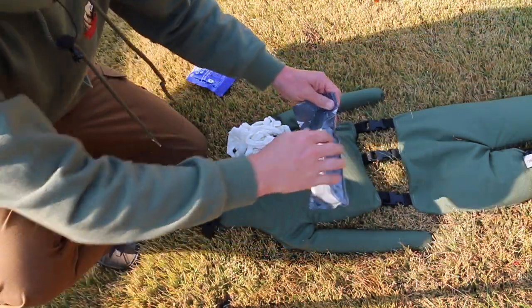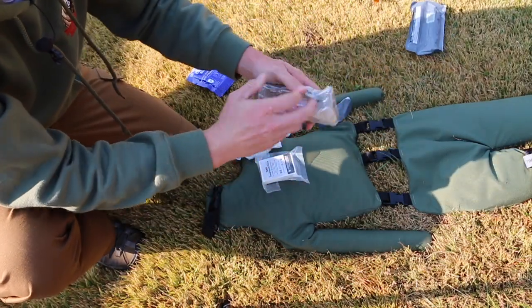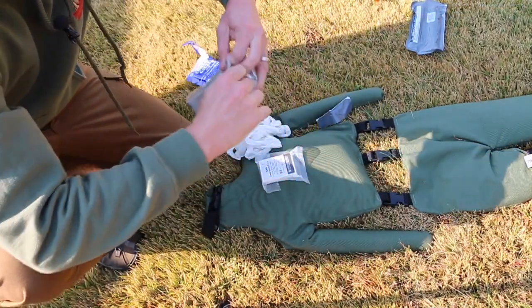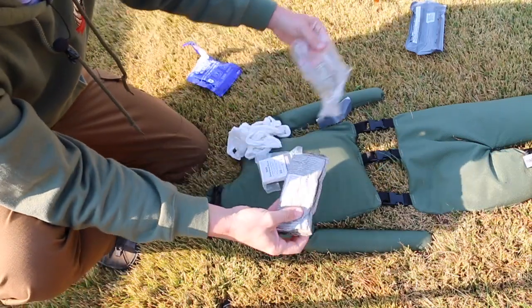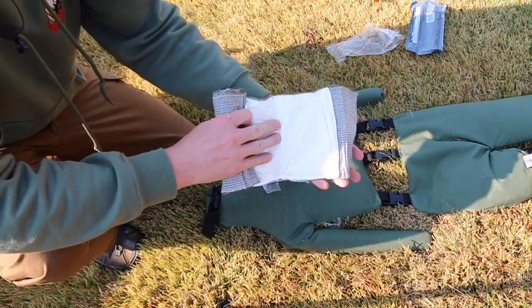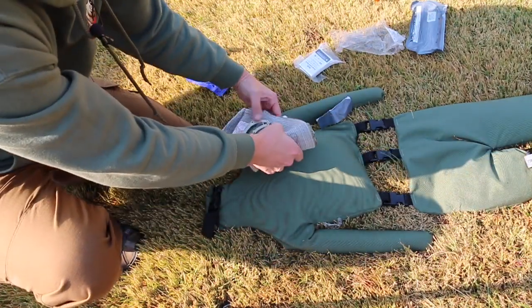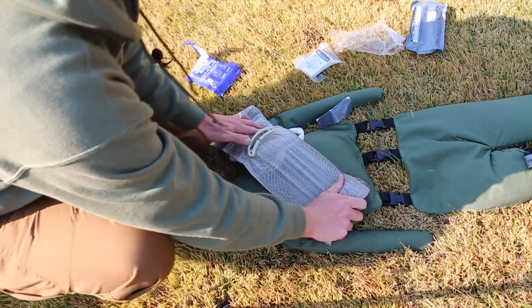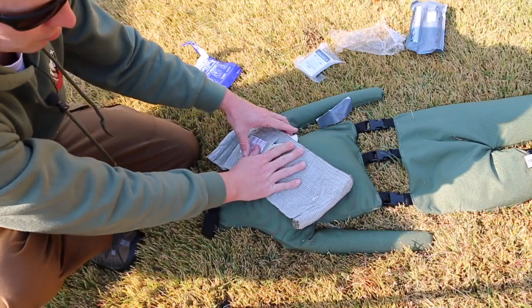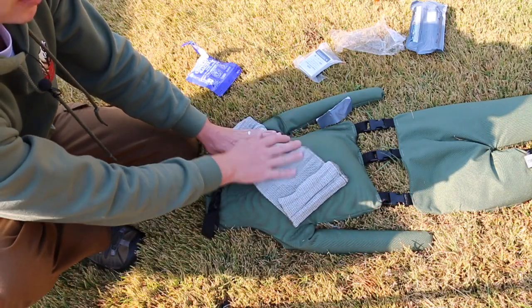All right, this is a little difficult on my little mannequin guy here, but you guys can get the idea. So Israeli bandage. Okay, this is a 6-inch bandage. There's our 5x9 that's supposed to be sterile. So this is our wound here. Wrap it. Now I usually don't use the pressure plate here when I'm just using it as a wound packing cover here. So this is going to hold pressure. We've already got bleeding controlled. We're just trying to keep all this controlled.